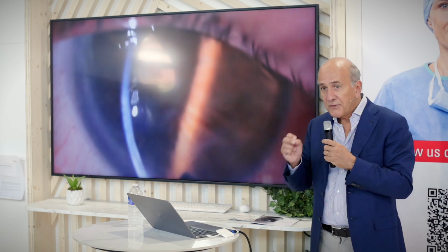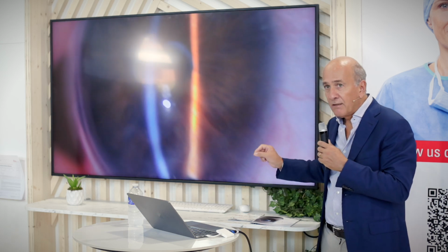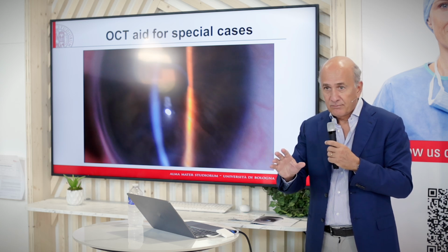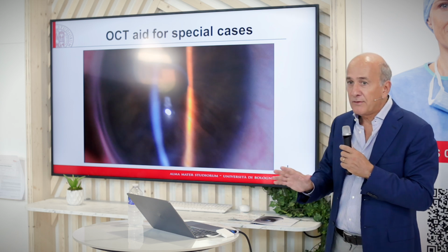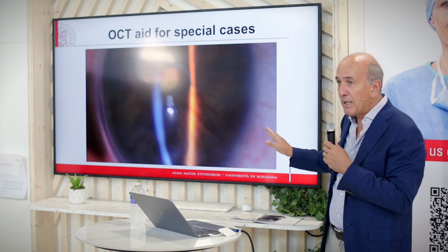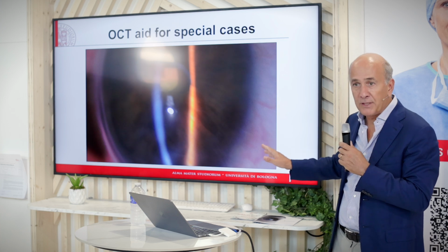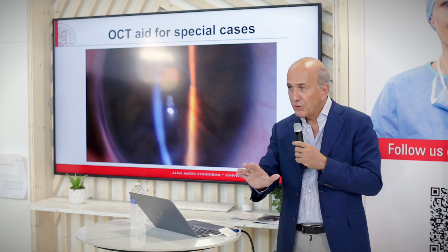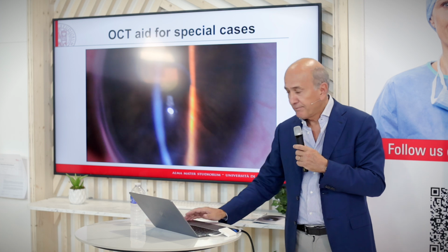Is this enough to convince you that this is a major add to the quality of your surgery? This to me is a major demonstration of something that I wouldn't be able to do without an OCT, and now I am able to do thanks to the high quality resolution of the Proveo OCT. But you may not believe that this is enough to convince you to spend this amount of money. So I'm showing you another case.